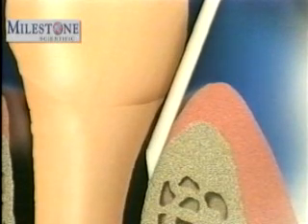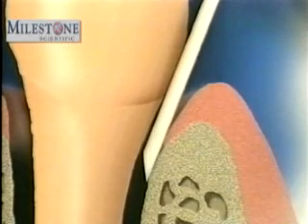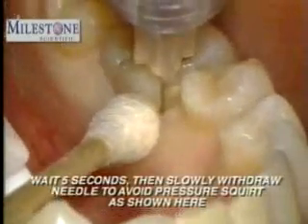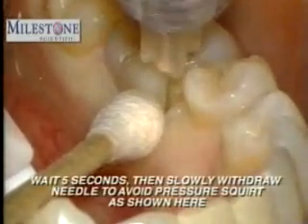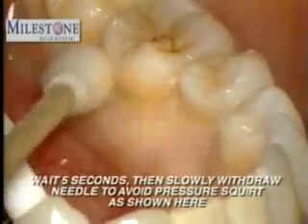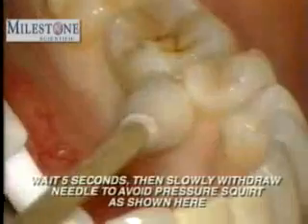Throughout the injection, it is also important that pressure be maintained on the needle to prevent the anesthetic from flowing back into the patient's mouth. Once you've concluded the PDL injection, discontinue the foot pressure and allow 4 or 5 seconds to elapse before removing the needle. Failure to do this will cause a pressure squirt of anesthetic in the patient's mouth.